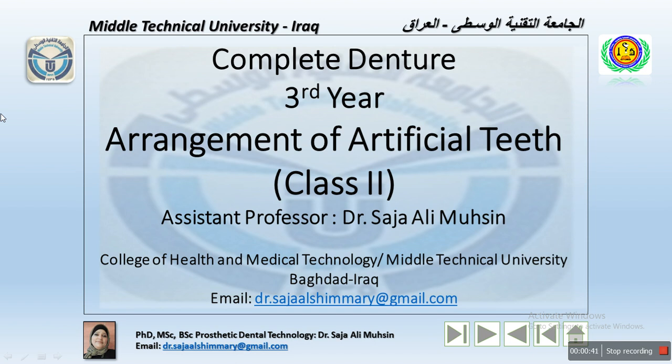Now, what I would like to say for today's lecture and for the next week, keep in mind that the setting of the upper arch will be the same in class 1, class 2, and class 3. The difference with class 2 and class 3 is only in the setting of the lower teeth, because in class 2 the maxilla is positioned a little bit forward of the mandible, as in class 1, the most commonly popular case.